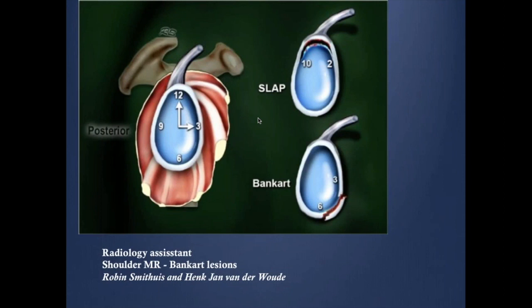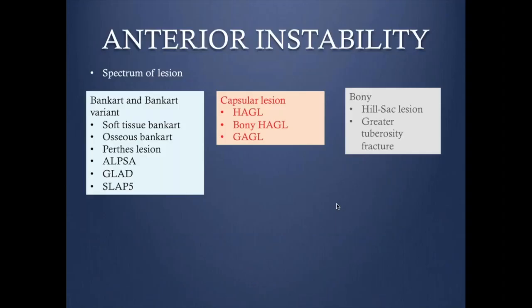Two spectrums of pathology can affect the labrum. We'll touch on each one briefly: the superior labral abnormality, classified as SLAP lesions — superior labral anterior and posterior — involving the superior labrum with anterior or posterior extension. And anterior instability affecting the anterior inferior part of the labrum, which is the Bankart variant. The best approach is to describe the abnormality rather than try to fit it into one of these categories.